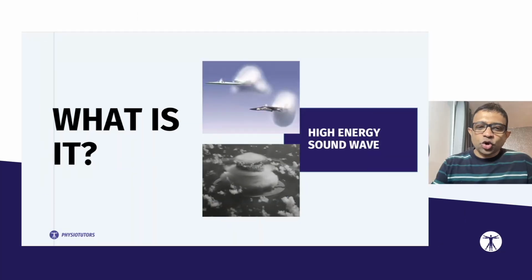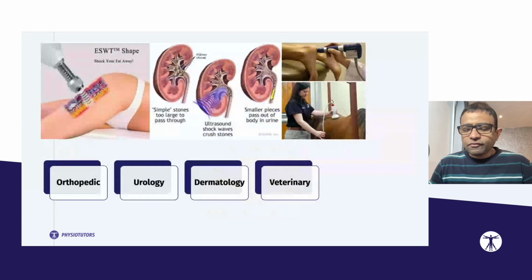So if you Google Shockwave, you might be surprised to know there's a wide variety of patient groups who receive Shockwave. Of course, my experience is only in MSK, but you can see that it's used in lithotripsy, which is for breaking kidney stones. It's also used in horses and dogs for tendon issues. It's also used for skin conditions like cellulite, and other areas. It's also used in cardiac, and in urology for men's health and women's health as well. So clearly it's got huge application and it's safe.